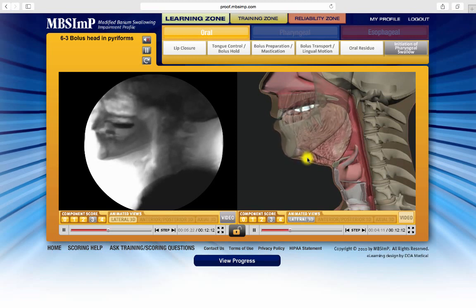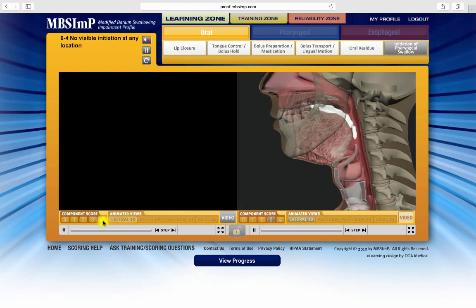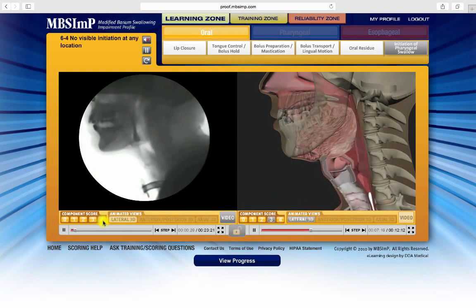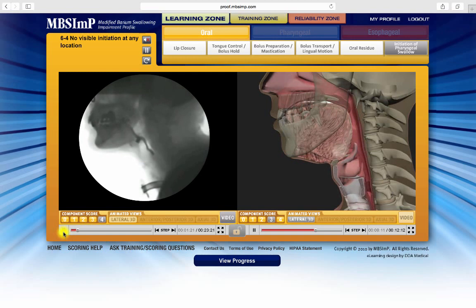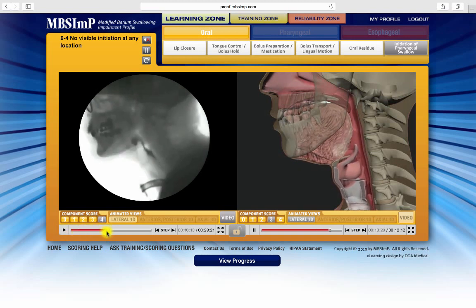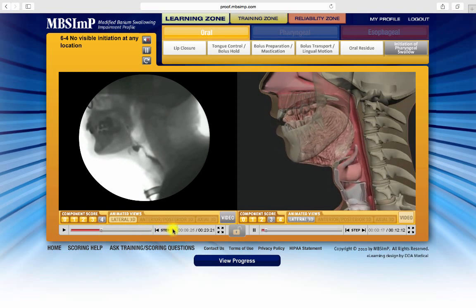Each window has a set of identical controls. Choose the score to study by clicking here. Then manage each window by using the pause-play toggle, the slider to advance or reverse the video, or move frame by frame with the step function here.